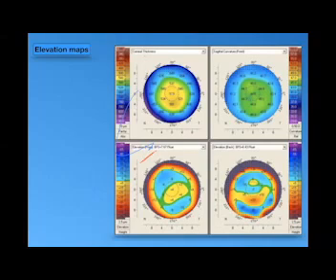Okay, the ellipsoid map to remove the factors, or to check for the factors which may be caused falsely by the astigmatism itself, because we have a lot of false high elevation with the astigmatic cornea. So it's calculated in the ellipsoid map to remove all these affecting factors. But the best fit sphere is the commonly used rule or map for the elevations. Okay, Ihab?